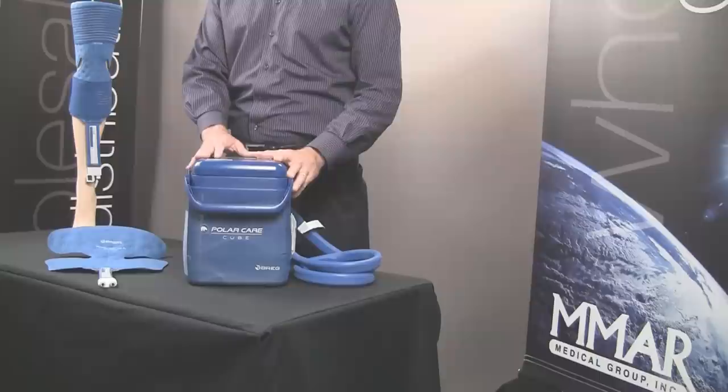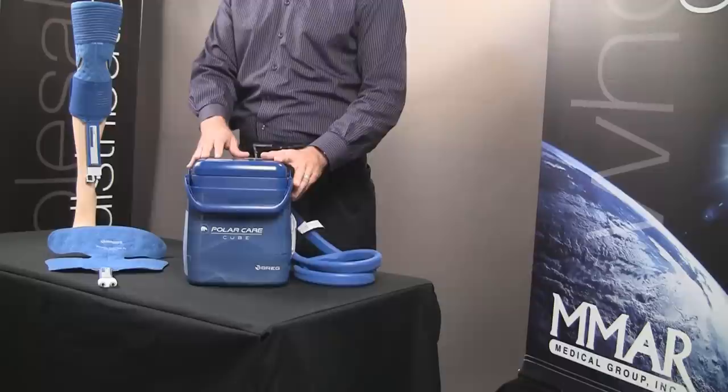We're going to review the PolarCare Cube by Breg, one of Breg's many product offerings in the cold therapy line.